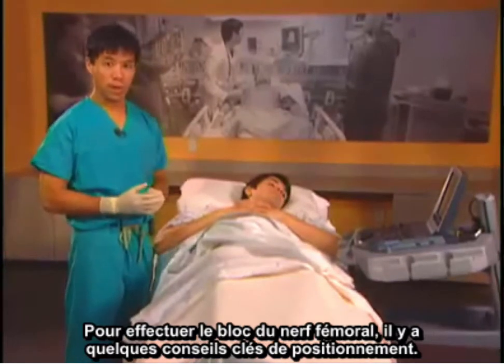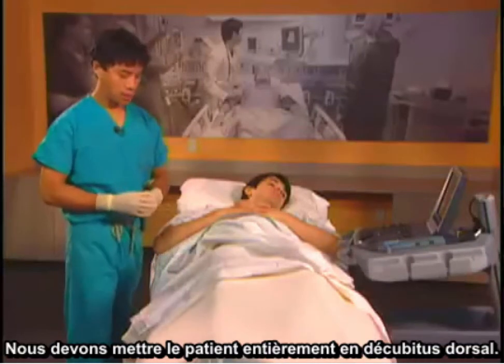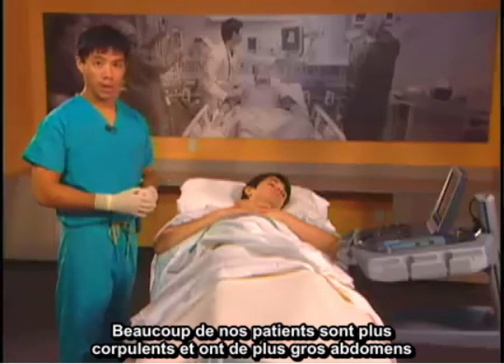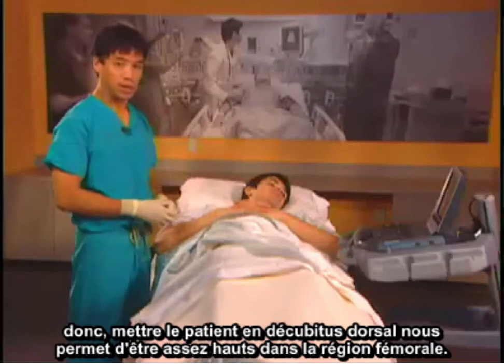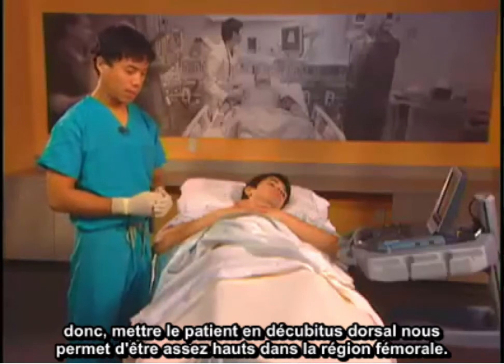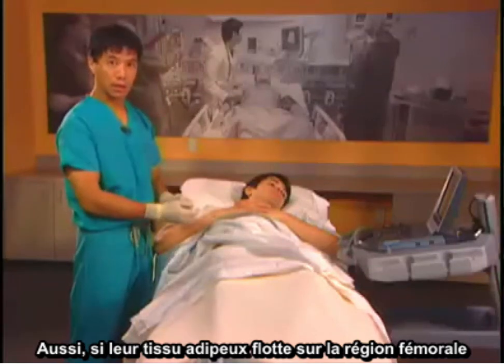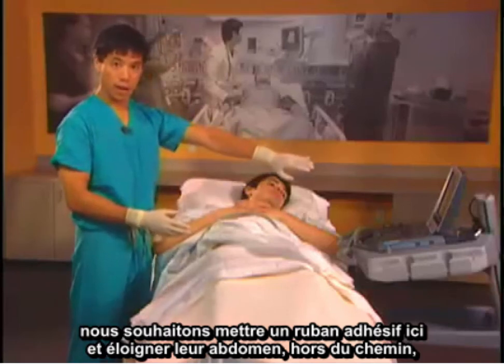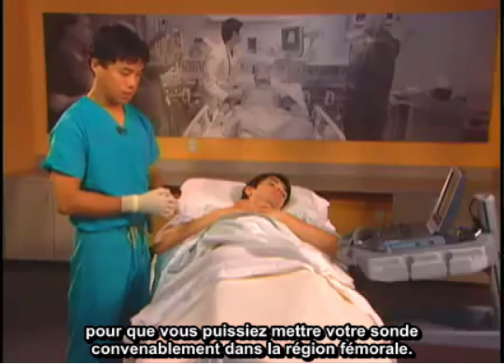To perform the femoral nerve block, there are a few key positioning tips. We want to put the patient completely supine. Many of our patients are larger and have larger abdomens, so putting the patient supine allows us to get high enough in the femoral region. If their adipose tissue hangs over the femoral region, we want to put tape here and tape their abdomen out of the way, so you can put your probe comfortably in the femoral region.